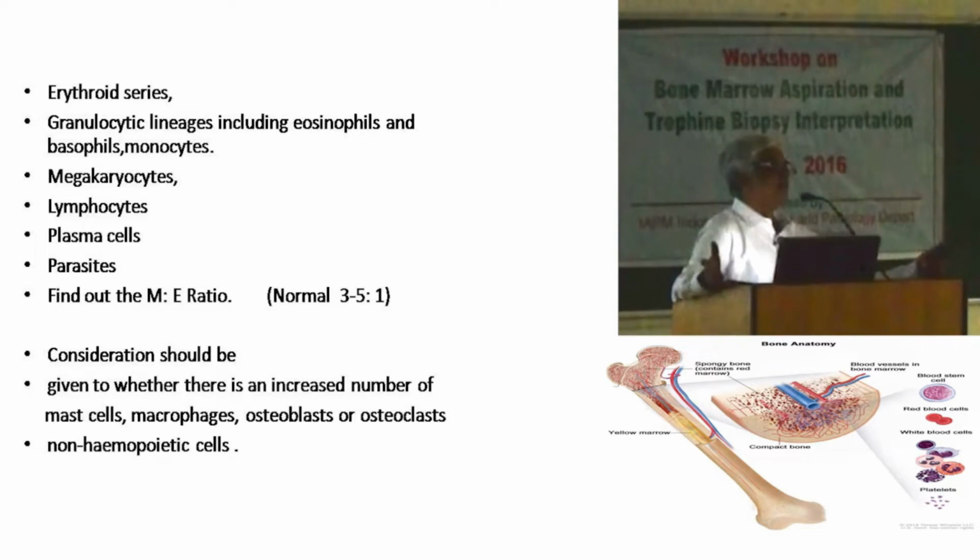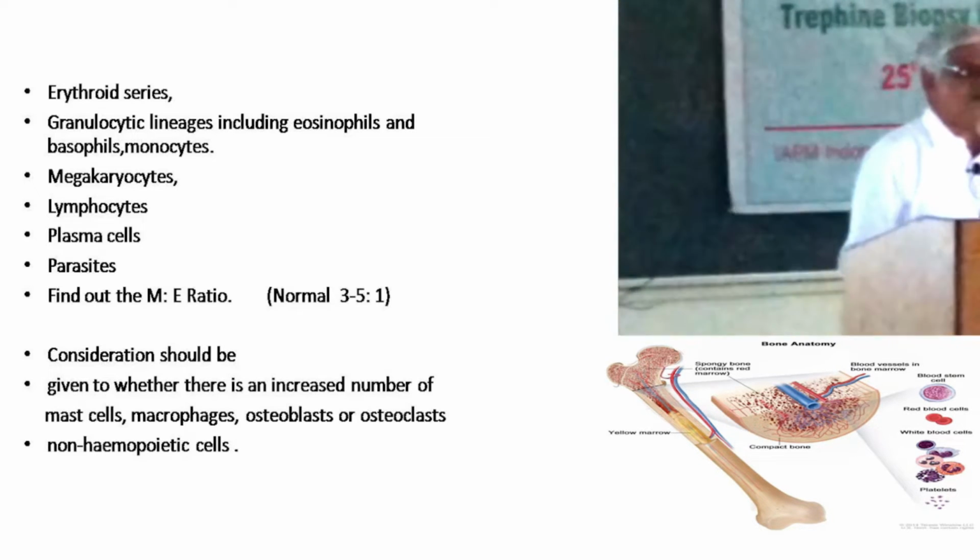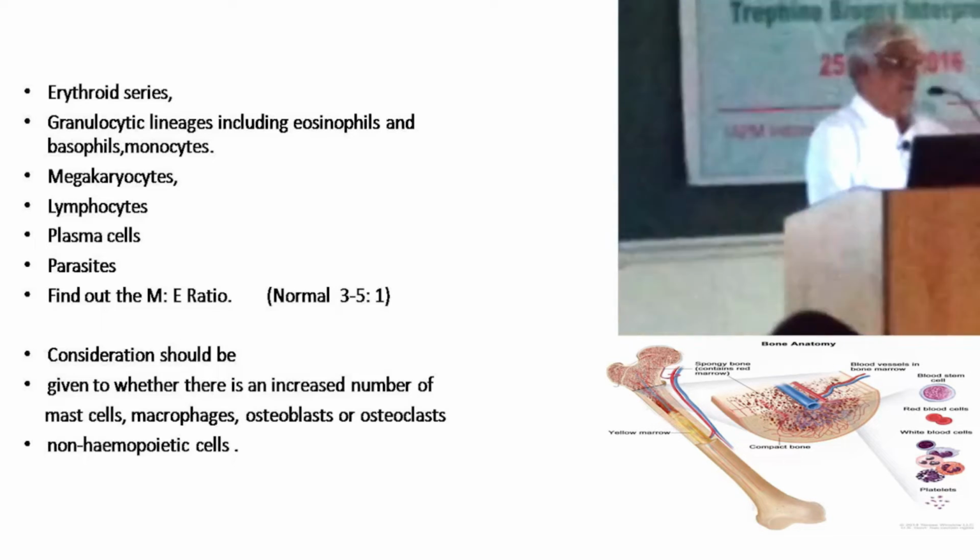You know that with malignancy, necrosis is very commonly seen. But this may be associated with ischemic conditions also. And then you have difficulty in seeing the normal cells in those marrows. So at that time you can report it as bone marrow necrosis also, because we had a case like this.